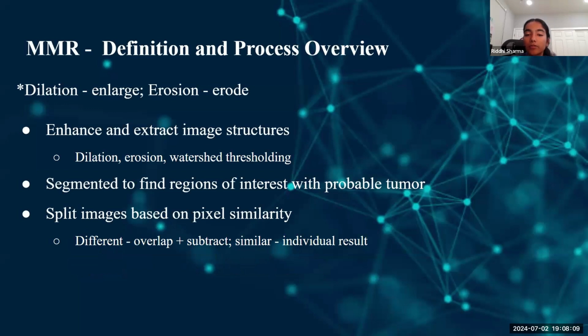The algorithm removes noise and artifacts by creating the marker image, which represents key points, and the mask image, based on the ROI and morphology operations for noise removal. Finally, watershed thresholding and segmentation is applied based on the concept of segmenting the ROI through a watershed line.